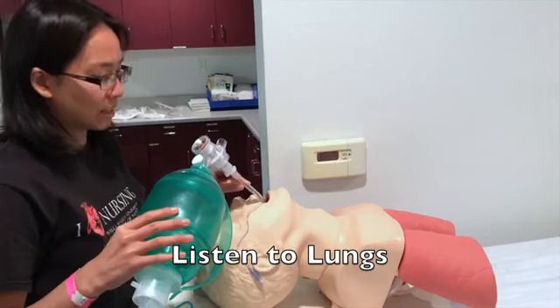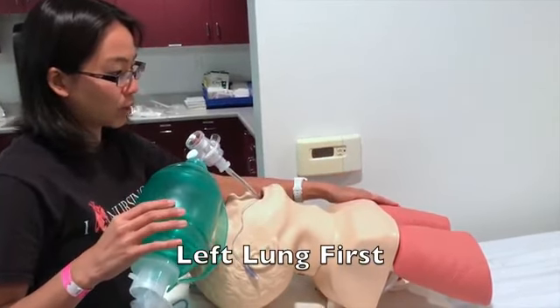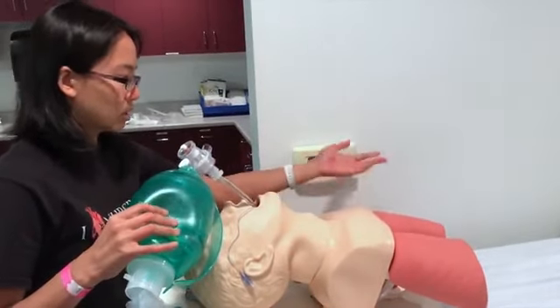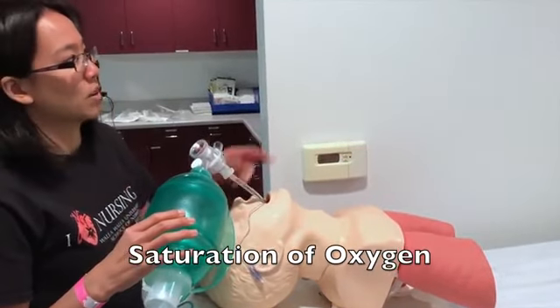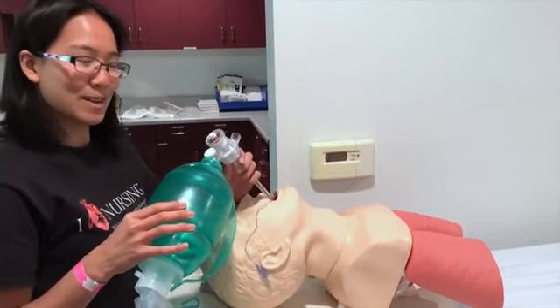L stands for listen to lungs. So you want to listen to the left side. You want to make sure you don't do an endobronchial intubation where it's just a right-side intubation. As you can see, it's a very clear view that there are bilateral breath sounds. And then the last S is O2 saturation. So again, you want that to be an appropriate number on the monitor. That's how you tell if you intubated someone appropriately.